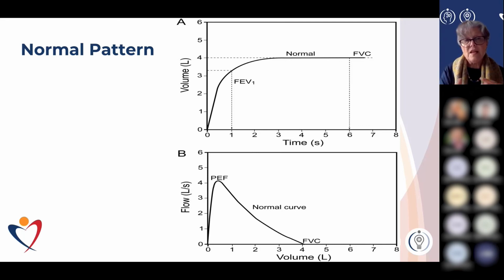What's interesting about the flow volume graph is that it gives us a pattern. And when we look at some other patterns in a moment, you can see how that can help us with our interpretation of spirometry.